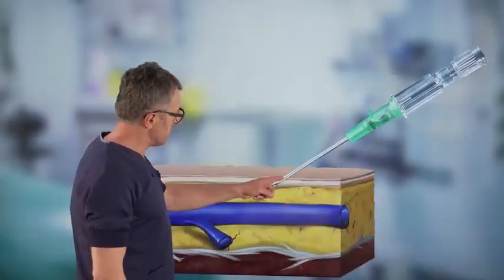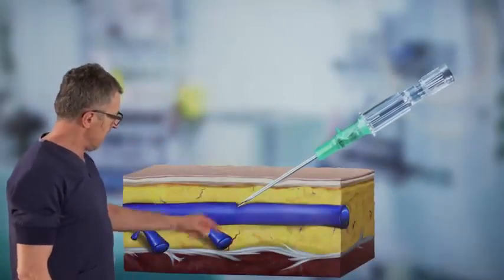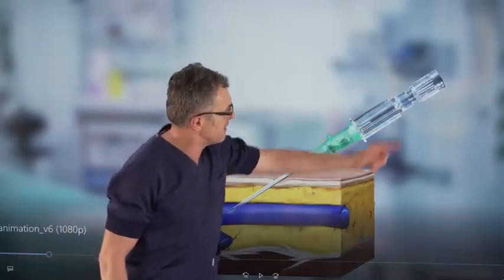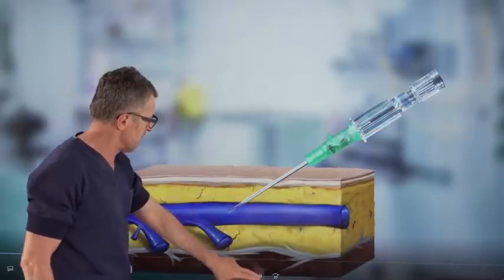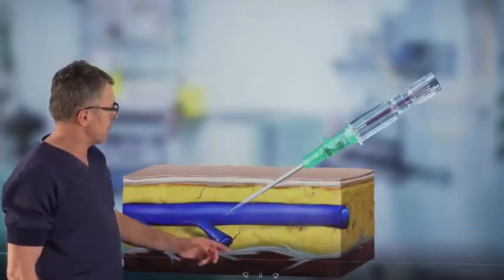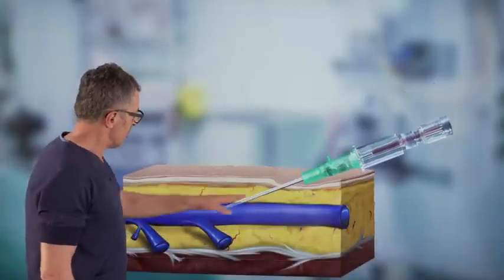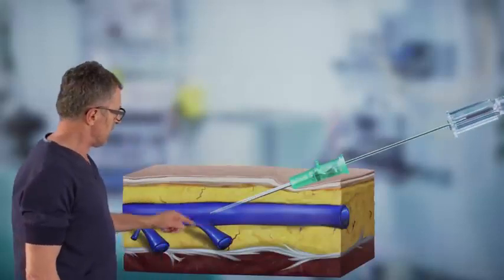So here's the catheter passing through the dermis and edging towards the vein. As soon as the catheter enters the vein, we will immediately see the flashback, as we call it, because the blood will want to go into the expansion chamber, and there it is. So now we know that we're inside the vein. At this point in time, what we simply do is continue advancing the catheter, lower the angle, and pull the needle out, leaving the catheter inside.